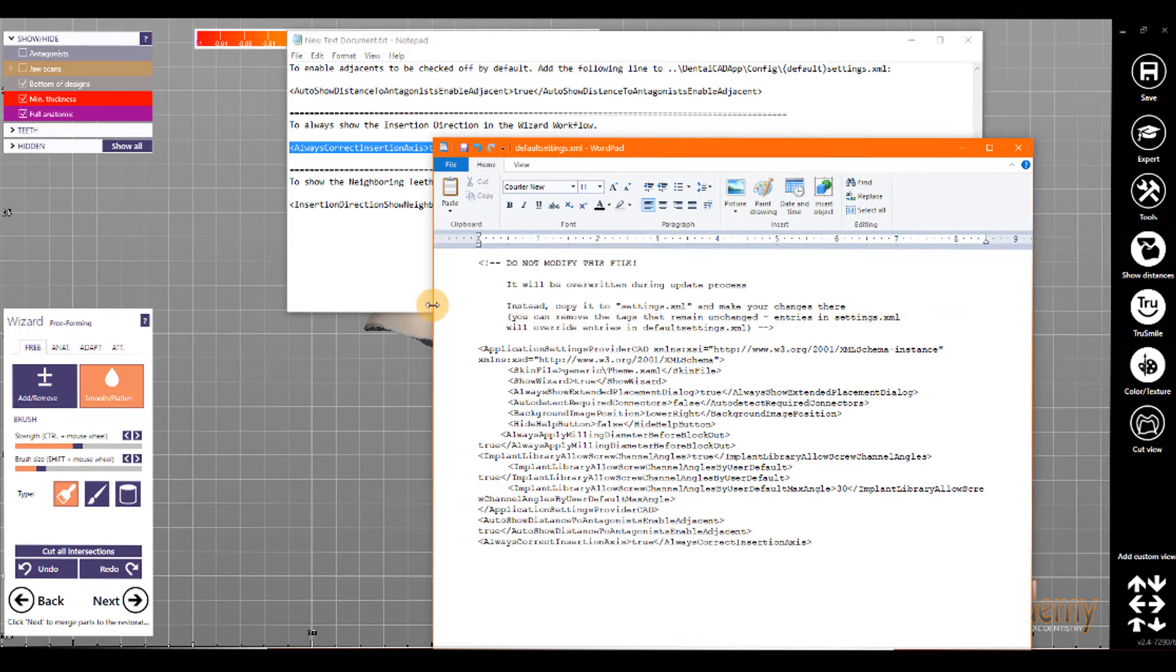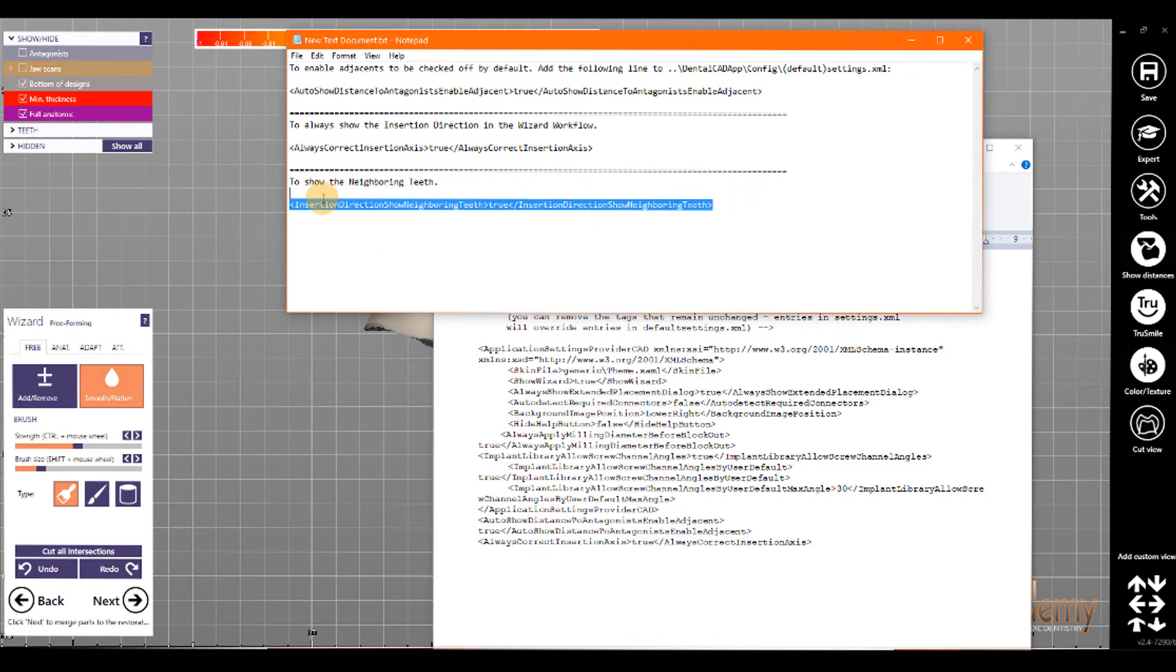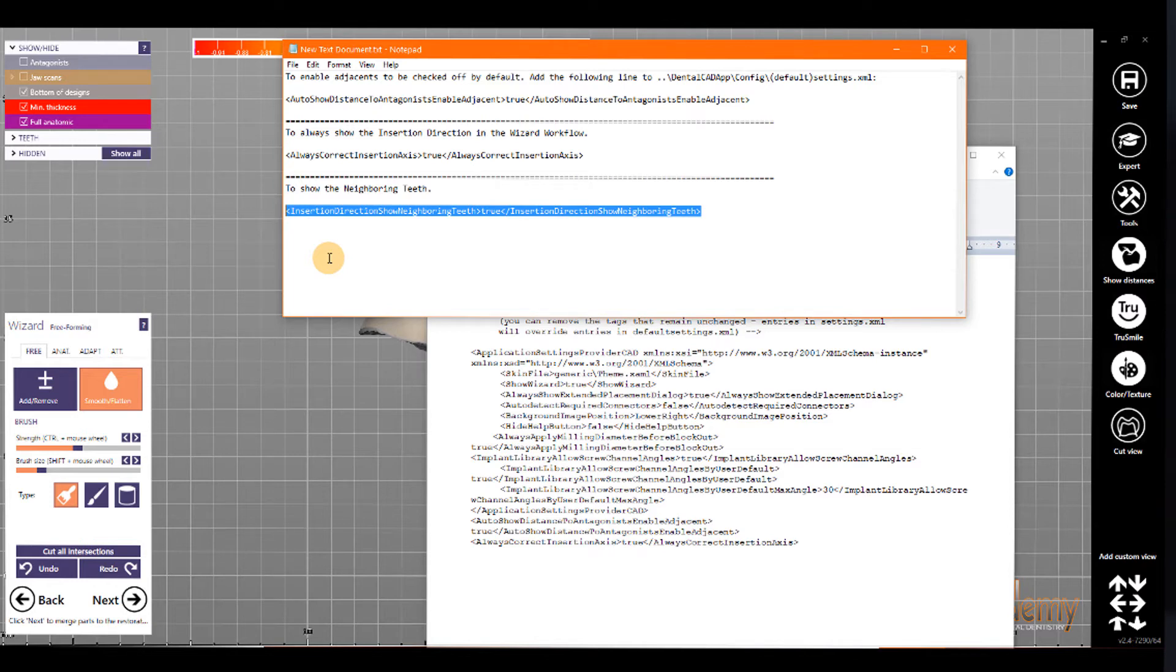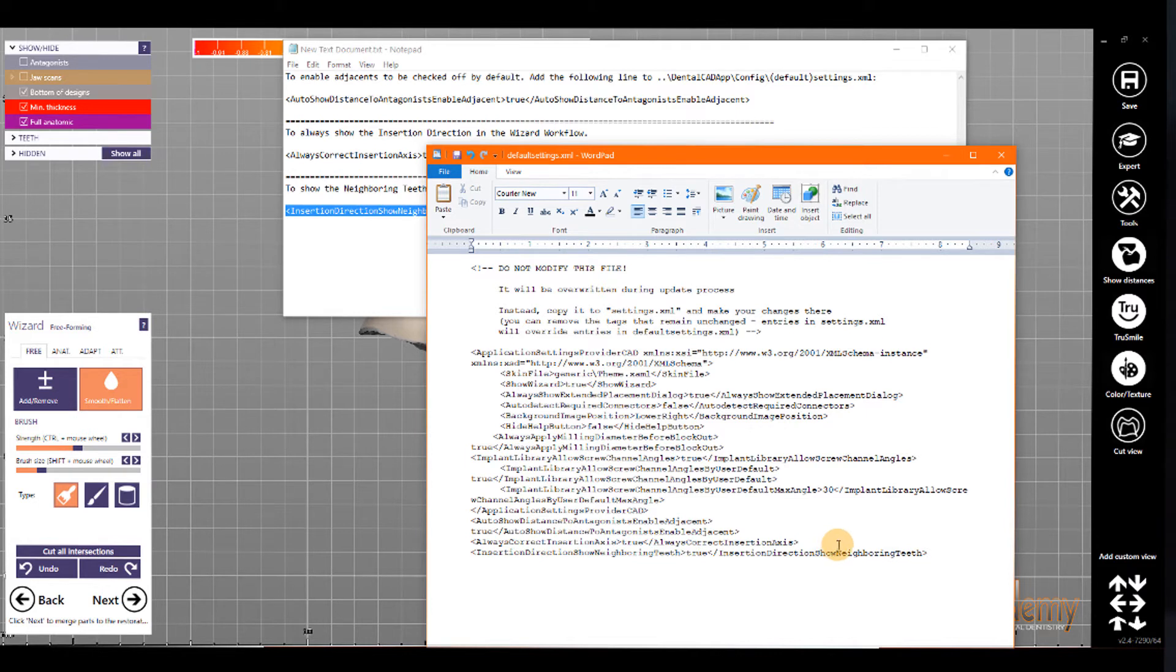And to show the neighboring teeth, instead of just showing the margin, I want to always show the teeth. I'm going to add the tag insertion direction. It's the tag, insertion direction, show neighboring teeth, and the value is true. So, I'm going to copy that, and paste that in our XML file.